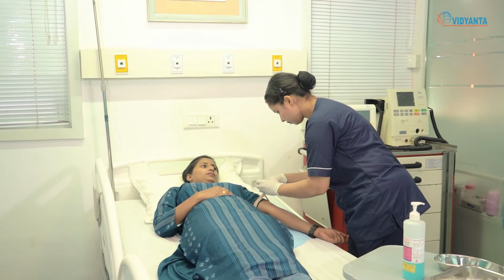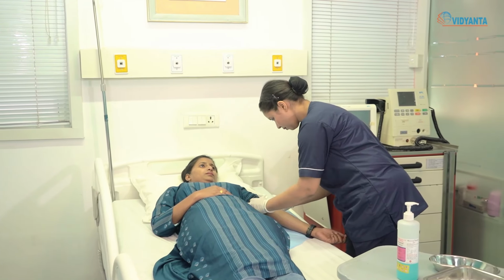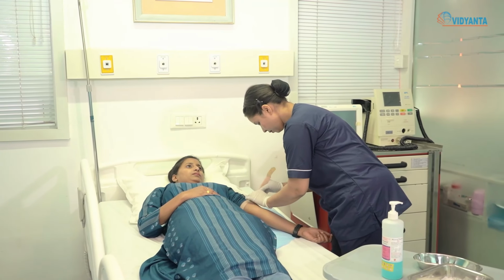Apply the tourniquet 3-4 inches above the collection site. Disinfect the selected site with the help of 70% isopropyl alcohol swab from center to periphery. Now withdraw the blood by applying a red Vacutainer. Immediately after taking a sample, release the tourniquet.